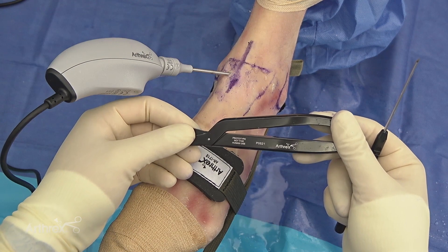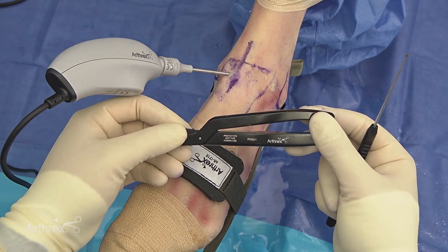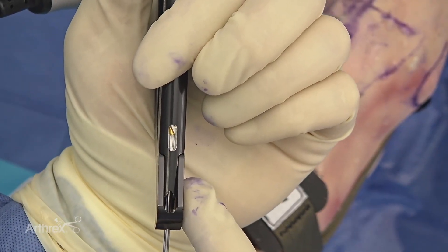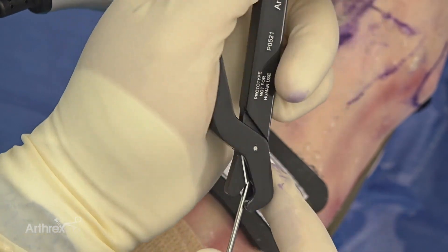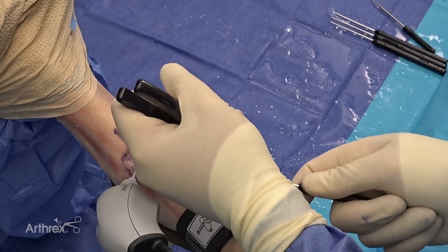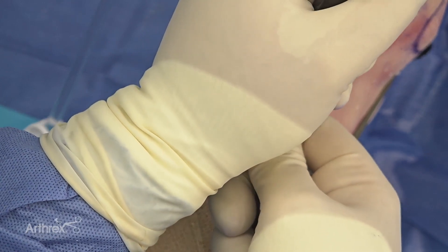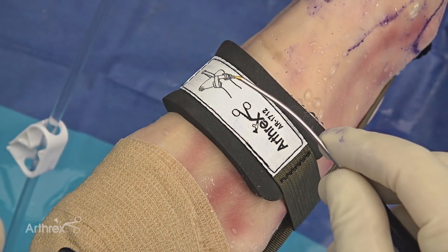Another benefit of this system is the reusable bending tool, which allows you to take your nanoscope instrumentation and bend it as desired to achieve a different working angle. You'll check to see that it's fully seated, and with the desired angle, you can either bend it slowly further away for a mild bend, or grip closer to get more of a bend — resulting in your desired angle.